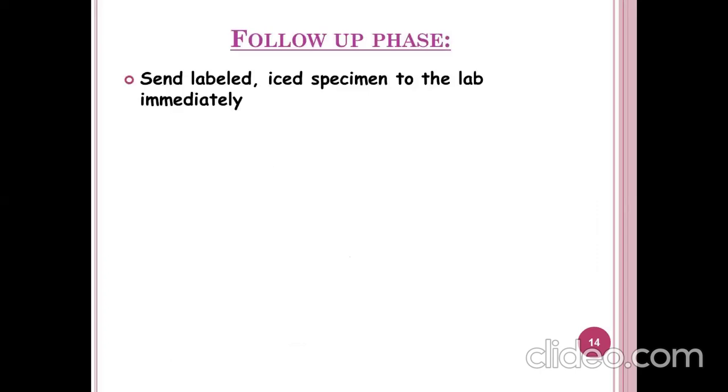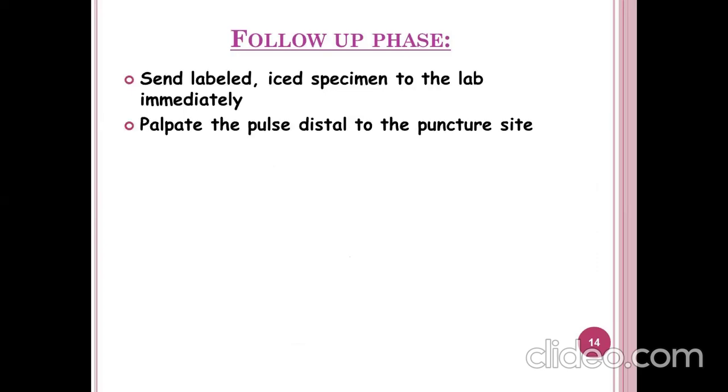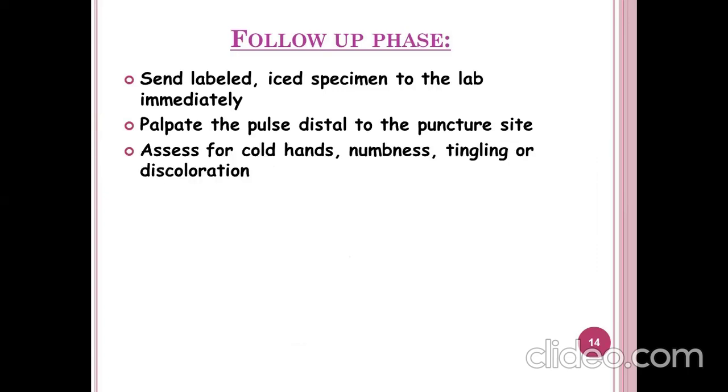So, the follow-up phase: send the labeled ice specimen to the lab as soon as possible. Palpate the pulse distal to the puncture site. Assess for cold hand, numbness, tingling, or discoloration. If there is anything, just observe and ask the patient whether there is any alteration or discoloration.